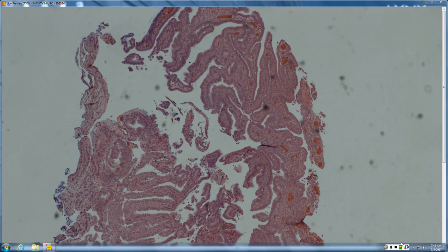The one that's probably the scariest, I will ask the fellows: what if you had something that looked a whole lot like an HPAP or an apocrine cystadenoma, but you're on the eyelid? What are you worried about? Endocrine mucin producing sweat gland carcinoma. So there you may want to get synaptophysin, some kind of neuroendocrine markers, because they start as hydrocystomas. Along the way, they look a whole lot like cystadenoma or HPAP, but they end their life as straight out mucinous carcinoma. So pay a little attention to site in terms of what that histology might mean.